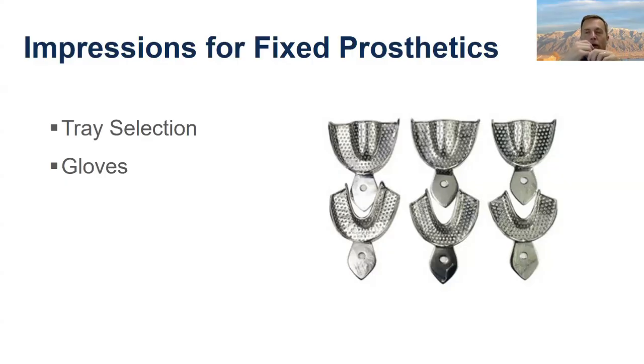But if you're doing a full mouth impression, where it just takes time to syringe around all the margins, then the slower set will help you, because you have to get the tray in the mouth before the working time expires. So I feel like that would be how I would decide. If I needed the longer working time to get the tray in, I'd use a longer set. Otherwise, I'd probably use a faster set just so the patient is less likely to move. Good question. Thank you very much.